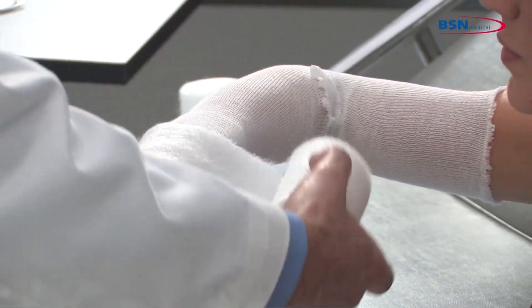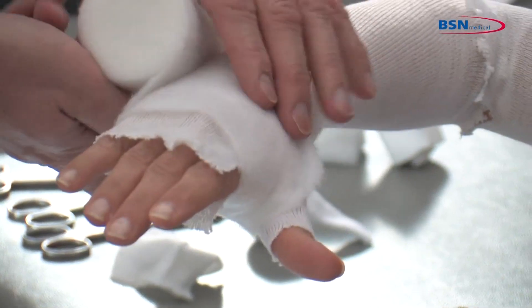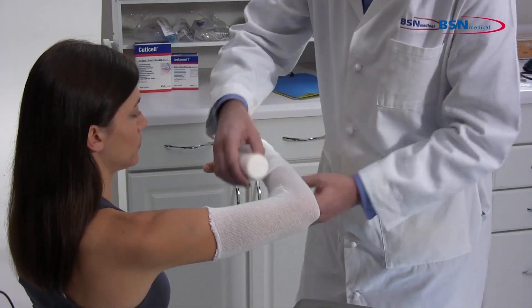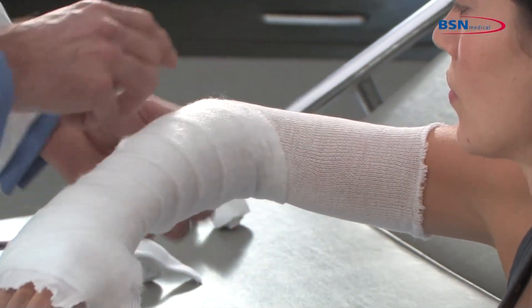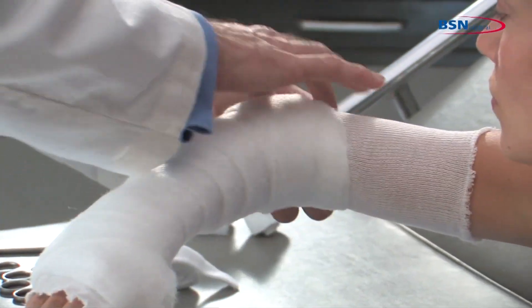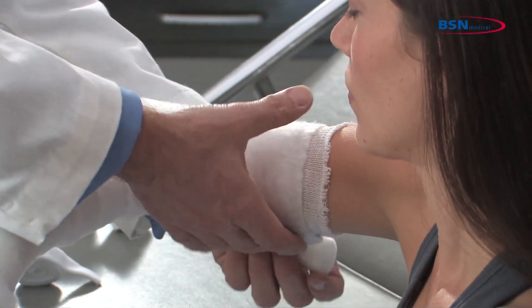Using 2-inch or 3-inch padding and starting at the wrist, go through the web space and work toward the elbow, overlapping by 50%. Continue proximally around the elbow to the upper arm. Avoid placing the edge of the padding in the anti-cubital fossa. Applying with a slight tension will allow the padding to lie down smoothly and have a snug fit. Additional padding may be required for bony prominences.